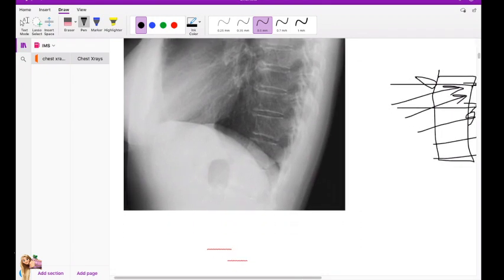One of the cases is if we're suspecting foreign body aspiration, we do not want the patient to inspire and push the foreign body more inside. So we'd like to take an expiration view. Anything else?